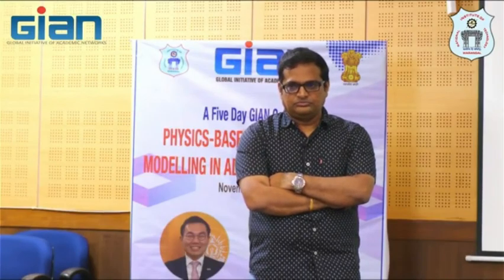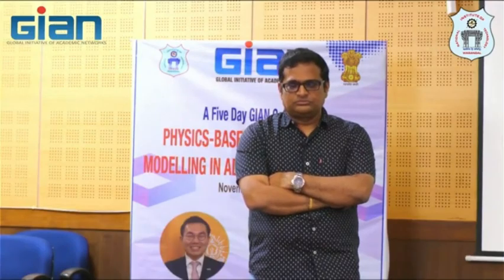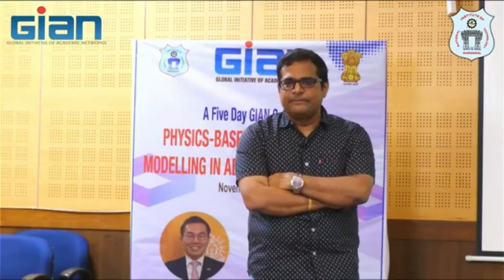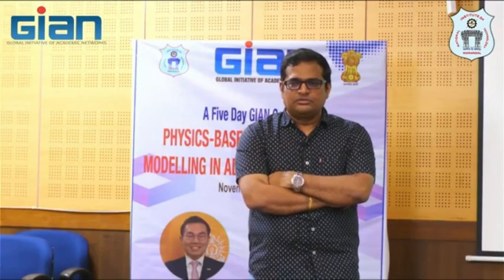The bone is defective because of the cancerous cells and all. So the defect region has to be captured and redesigned, the negative part of that defect structure has to be incorporated. If it is a symmetric defect, we will mirror it and redesign it. But if it is asymmetric, we need to do it from scratch. Mostly what we see is an asymmetric structure, and that has to be incorporated into the implant.